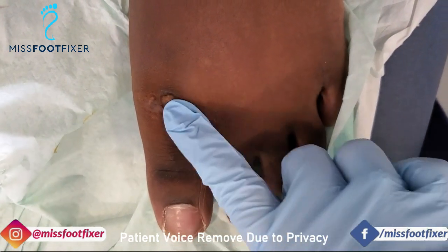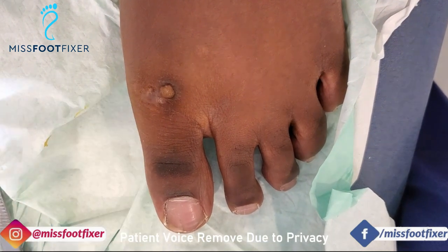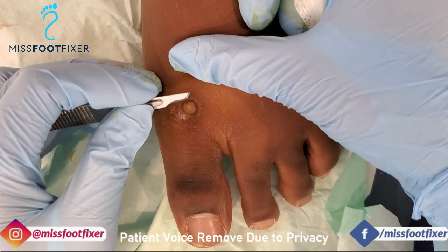So what I did was I already did a local anesthetic, so this is numb. What we're gonna do is cut that back, put some silver nitrate on it, and then do a bit of lasering because that's what worked before. So it's gonna be a bit bloody.